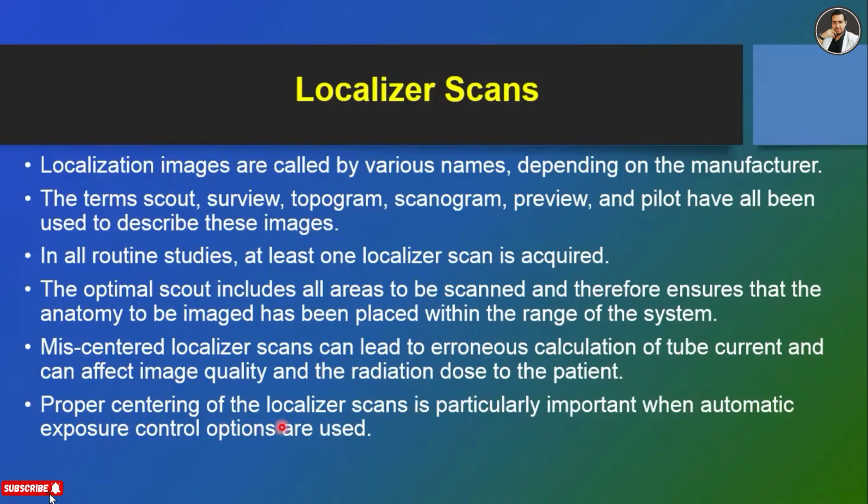Proper centering of the localizer scan is particularly important when automatic exposure control options are used. Automatic exposure control is used in many machines. So, in the end, we must center properly.